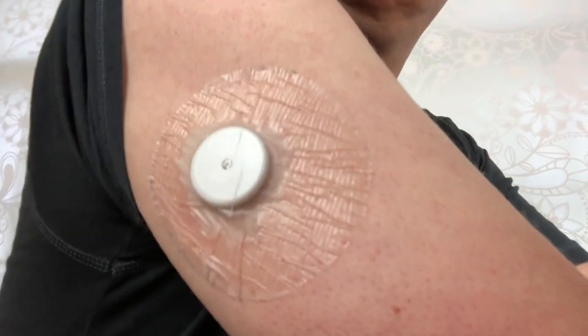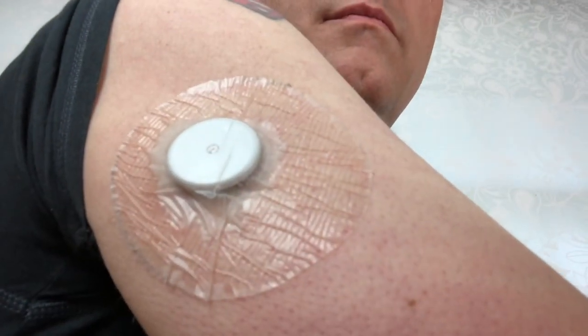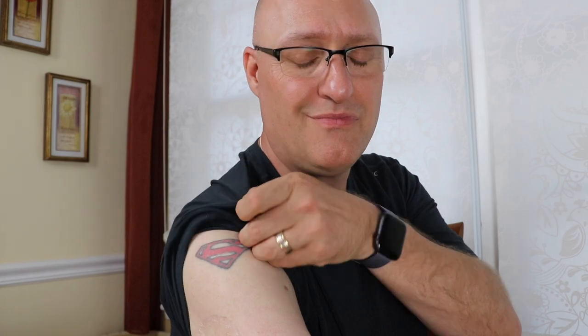Hello everyone — it's been seven days and I wanted to check in and give you an update on how my Freestyle Libre sensor is working with the protective skin we talked about a week ago. If you take a look, it's in really good shape. The only thing I would tell you is the edges are starting to come loose a little, but that's pretty standard. Everything else looks really good — it's holding, no problem there. Check back in a week when we take it off.